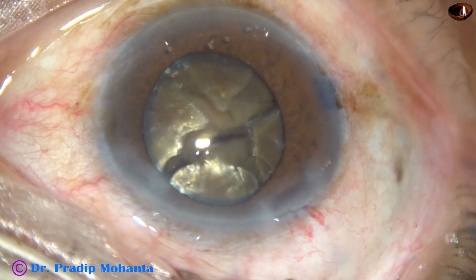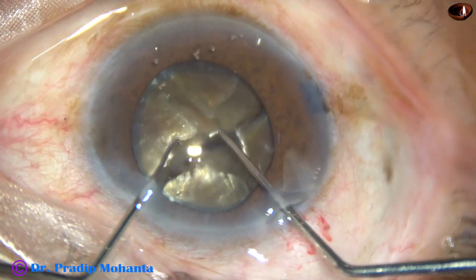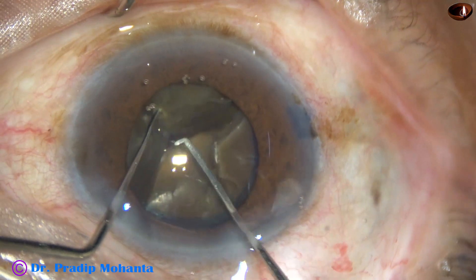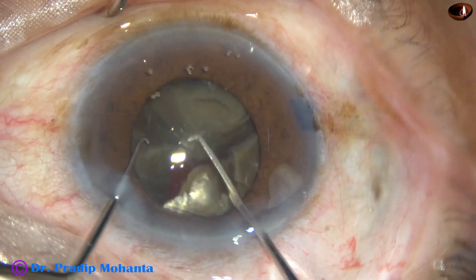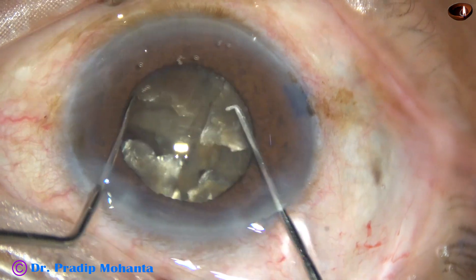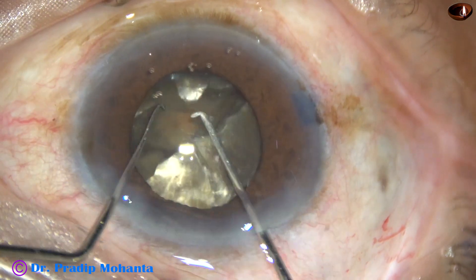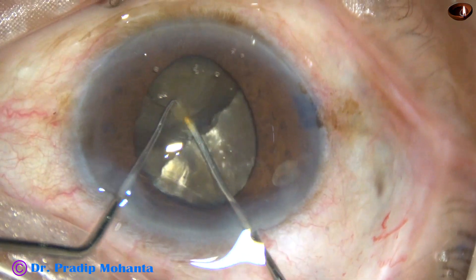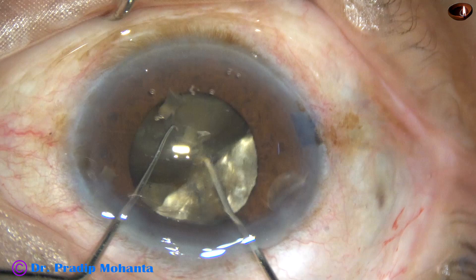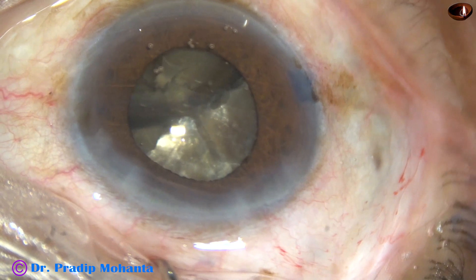This is the technique. Take two Sinsky hooks, or a blunt chopper and a Sinsky hook — in my right hand is a blunt chopper going behind, and the Sinsky hook is above. The two fragments are completely separated from each other. Rotate, come to the other heminucleus. Tilt — the chopper goes behind, the Sinsky hook works from above, cuts the leathery fibres, and the fragments are completely free now.